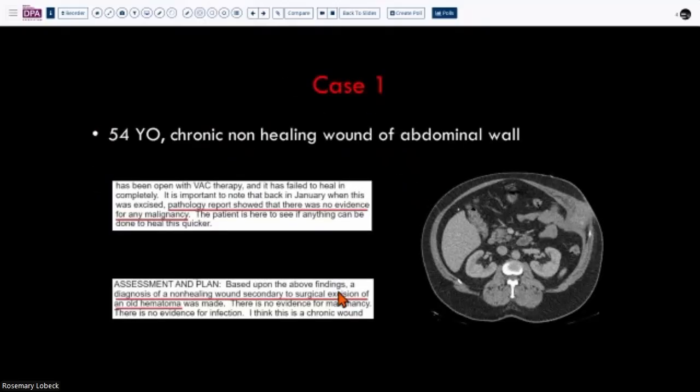So here's my red category case number one. We have a 54-year-old patient who presents with a chronic non-healing wound in the abdominal wall. You can see this over here. In the abdominal wall musculature, there is an ill-defined lesion that seems to push into the peritoneal cavity and also into the subcutaneous adipose tissue, with perhaps some ulceration of the skin.